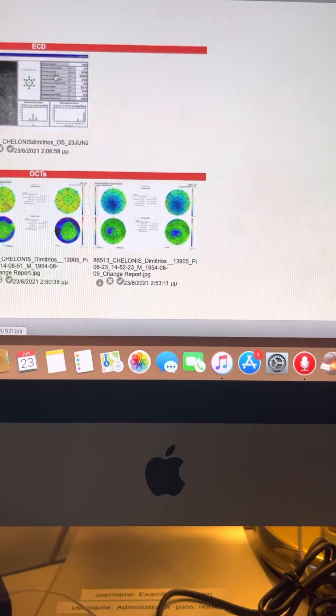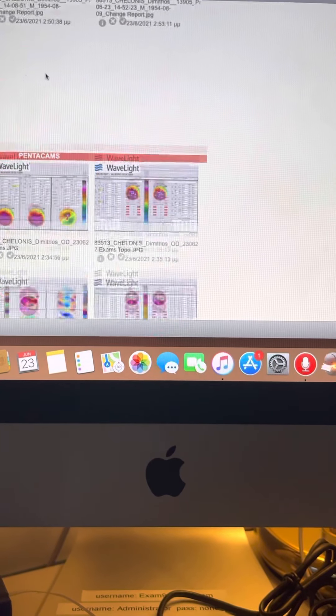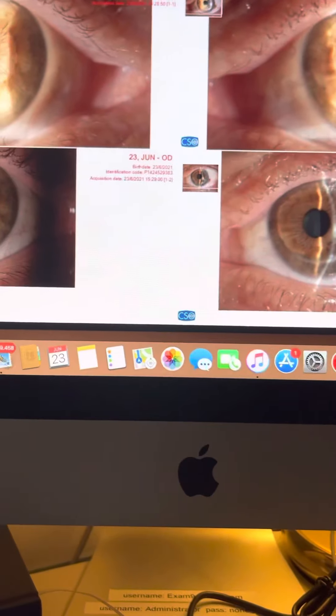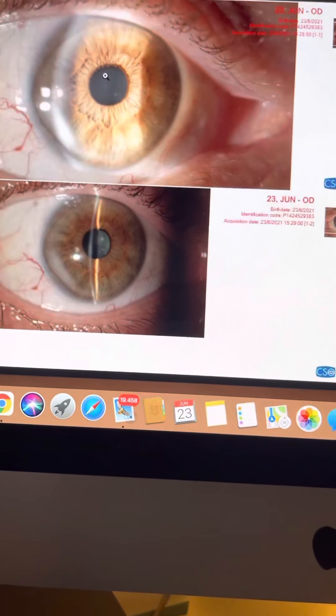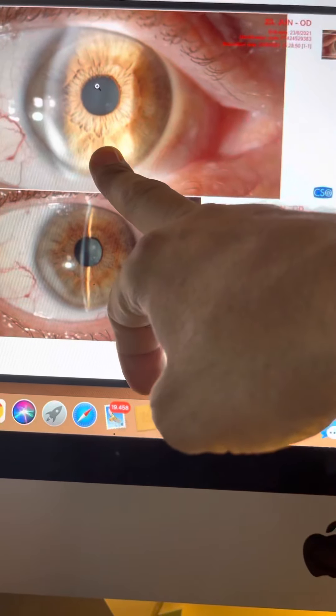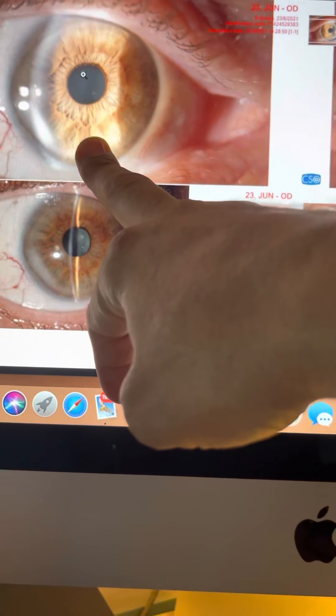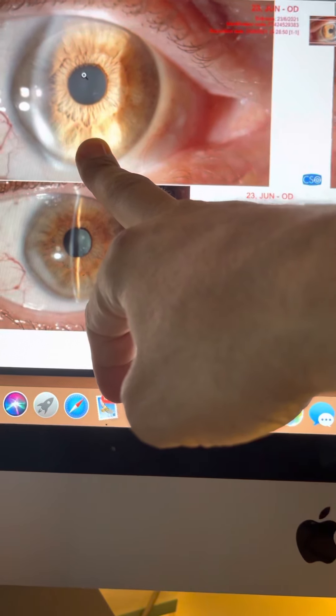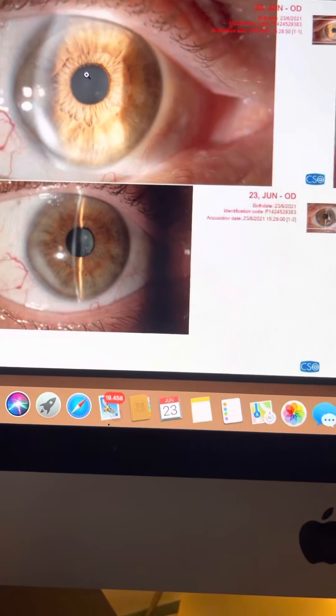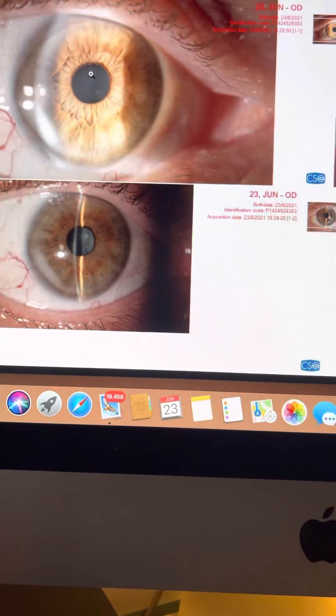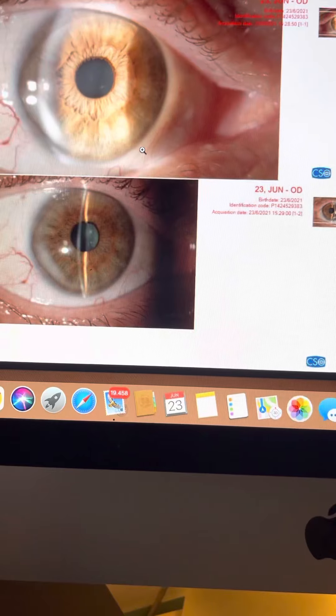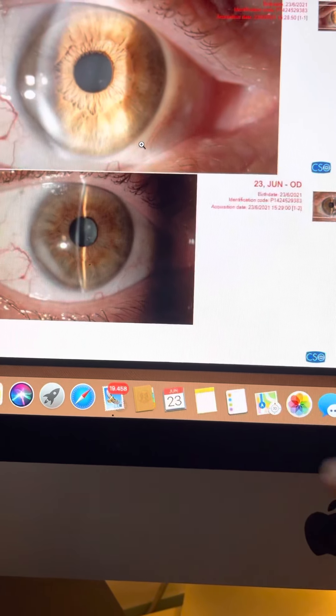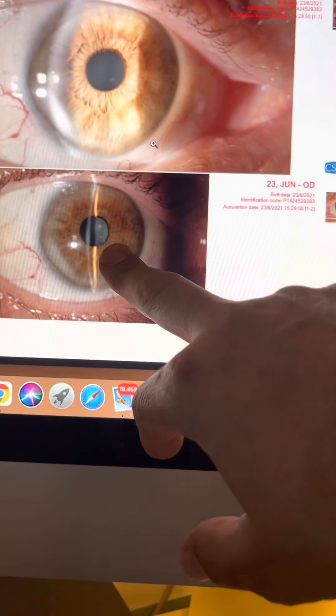So, going back to this very interesting patient who poses a cornea management issue, we're not doing a CXL procedure here despite the fact that the pentacam maps show some worsening because the anterior segment OCT Avanti confirms there's no change.